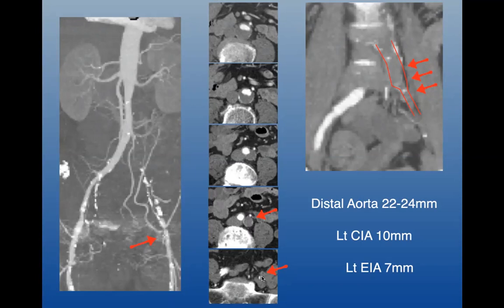Showed me where the occlusion is, how long it is. I'm able to measure the vessels and get a size so that if I am successful at crossing this occlusion, I can basically determine from the CTA alone what size stents I need, what size balloons, what I'm going to treat, what my approach is, and so forth.